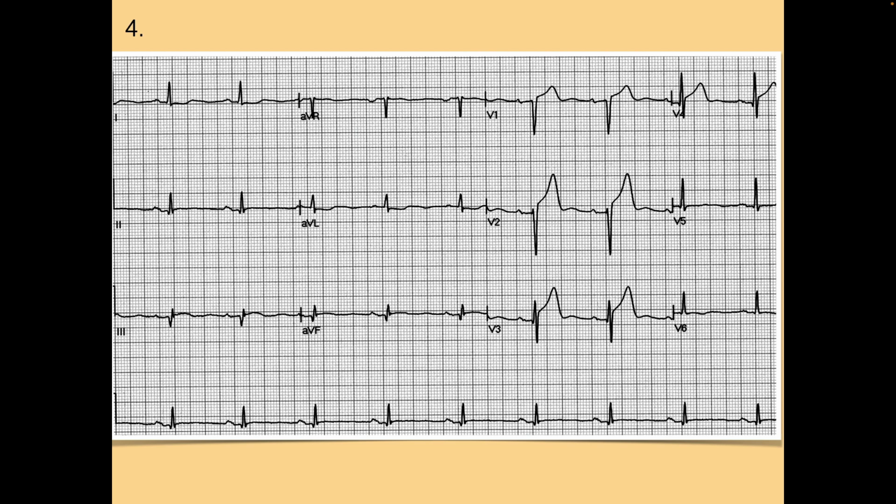Questions about this? Would you consider those peaked T waves? Probably more likely, and we're going to be talking about this in about 15 minutes, I would consider them hyperacute T waves.